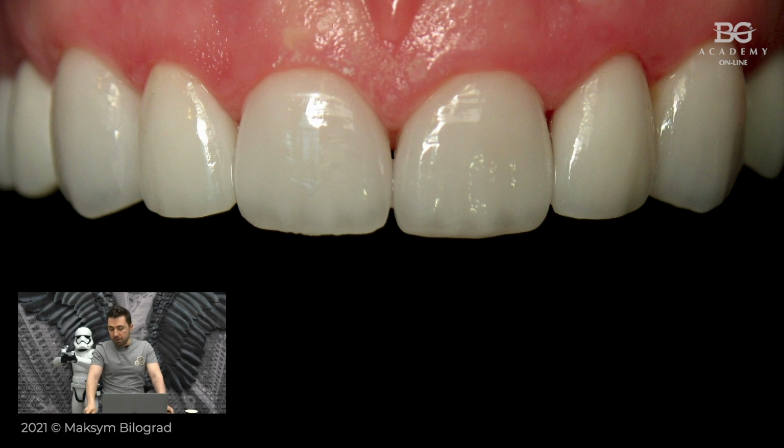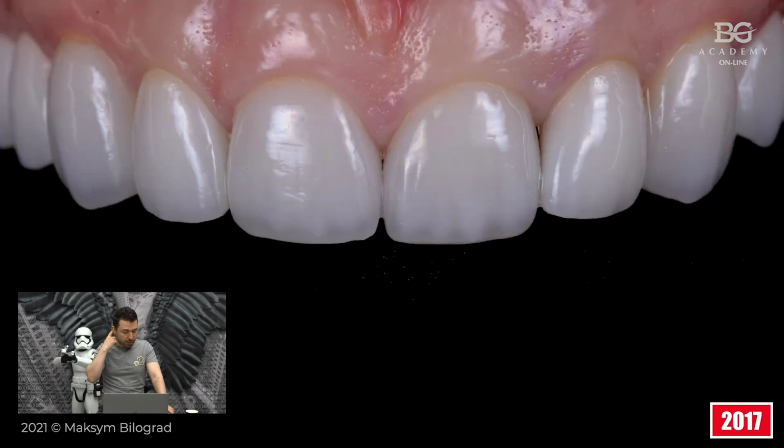And now I consider that BL shades of restorations can be done. For this patient, they were very fitting because she's blonde, her skin is white, her hair is white also, eyes are blue. Everything was matching each other, and she was very happy. Later on she also made lower teeth. And I learned a lesson from the case. Here we have, by the way, the follow-up, 2017. Still they are in place, so it's more than 10 years now.